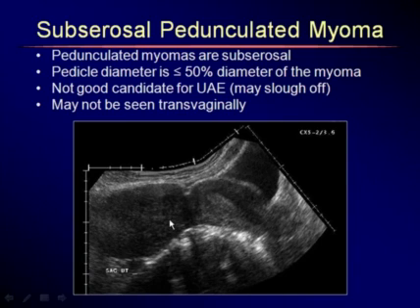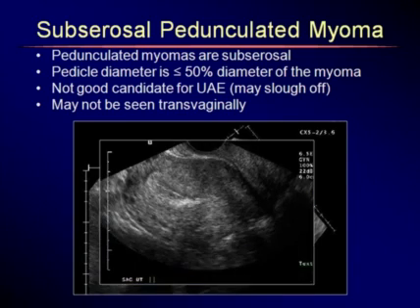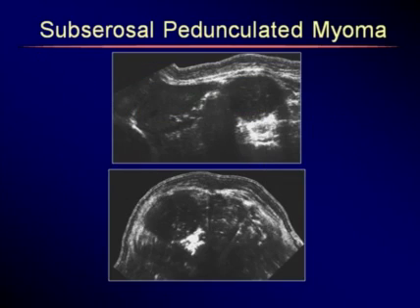So that's a pitfall of transvaginal sonography, such as here. Here we fit in the uterus, pretty much, not even the cervix, but there was a pedunculated myoma attached. It was completely cut off the image. So if one has the transabdominal image first, it is very helpful then with your transvaginal exam.